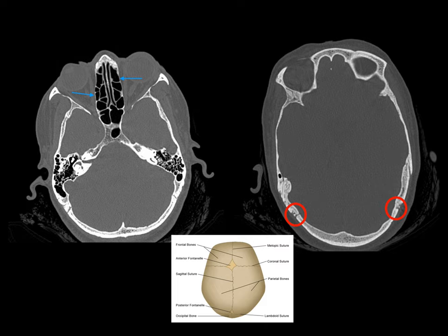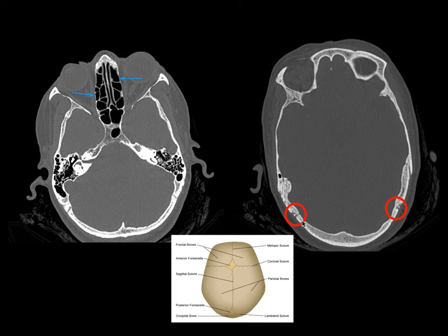The bone window is very important. Look at the orbits, orbital walls, temporal bones, and lamina papyracea. Fractures are common — look for herniation or entrapment of the extraocular muscles. Look at the sutures carefully, which should not be confused with fractures. Fractures very close to a suture are commonly missed, so careful scrolling is important.